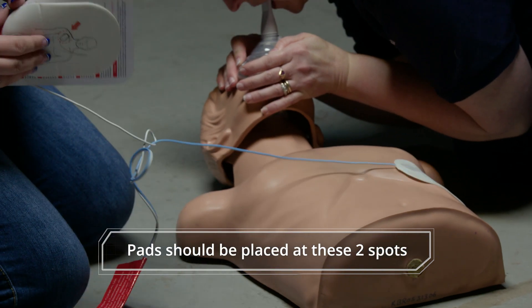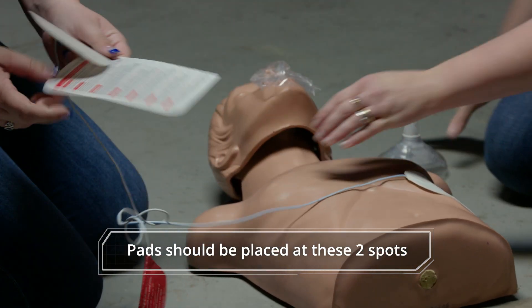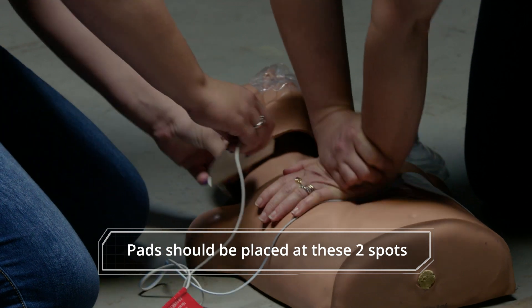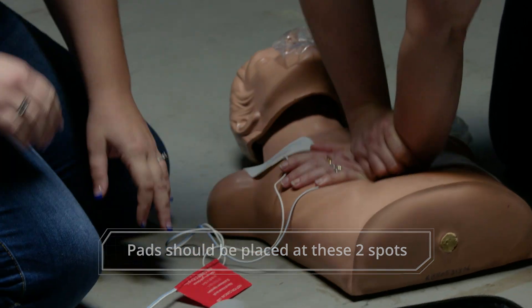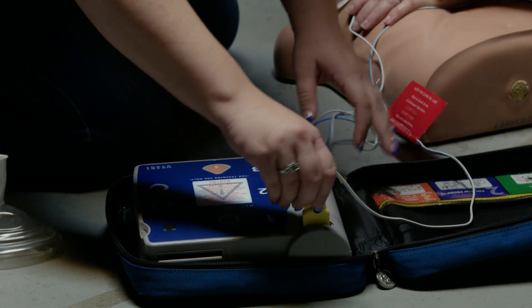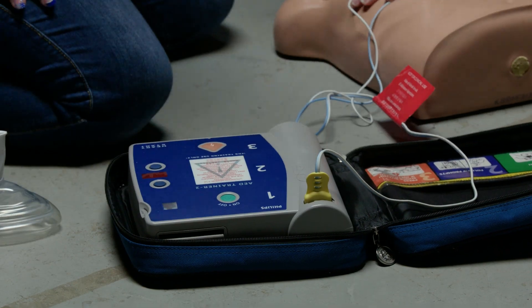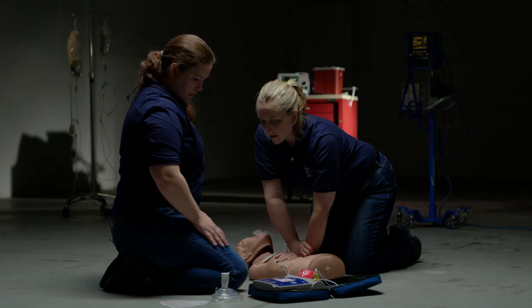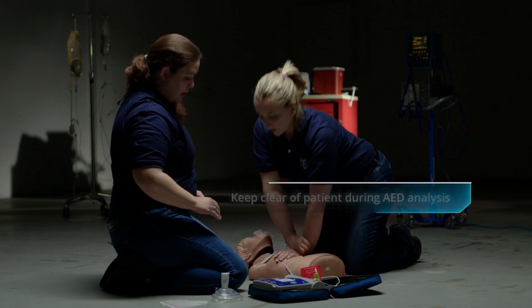Plug-in pads connector next to flashing light. One, two, three, four, five, six, seven, eight, nine, ten, 11, 12, 13, 14, 16, 17, 18, 20, 21, 22, 23, 24, 25, 26, 27, 28, 29, 30.